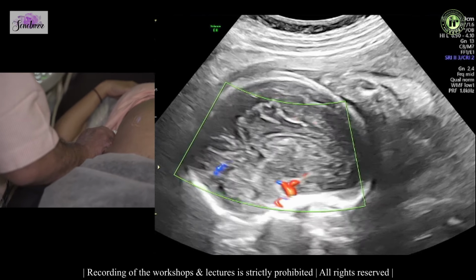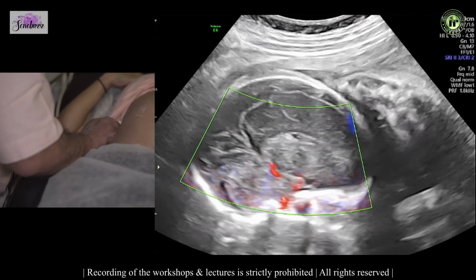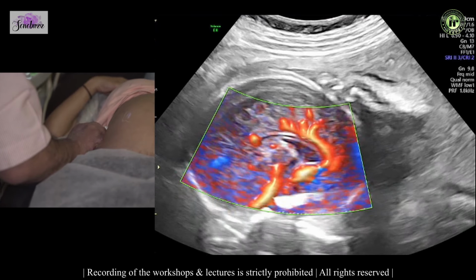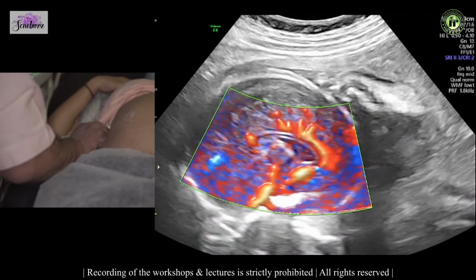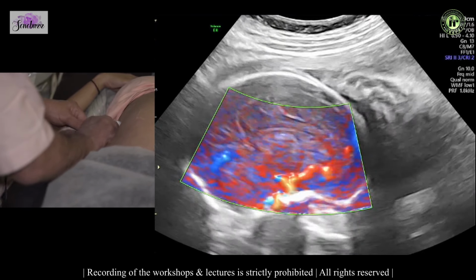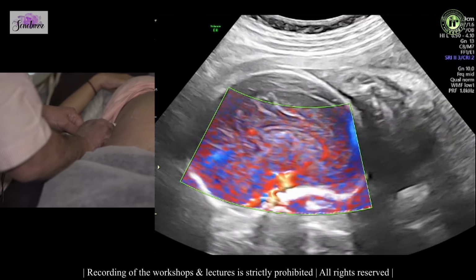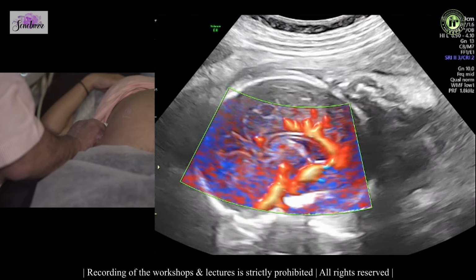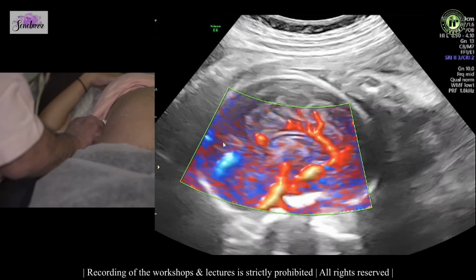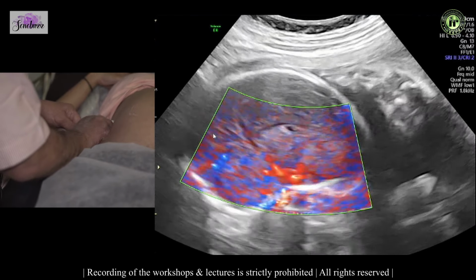We will try again whether we can see the blood flow. Yeah, now we can see the beautiful pericallosal artery, which highlights the presence of a normal corpus callosum. That is the straight sinus here and the superior sagittal sinus.